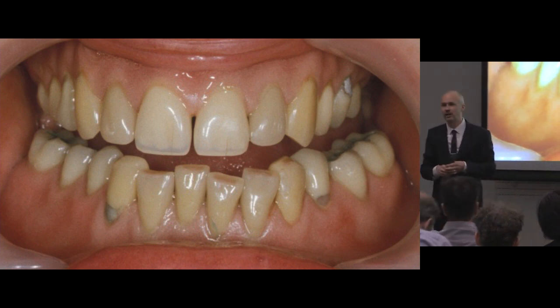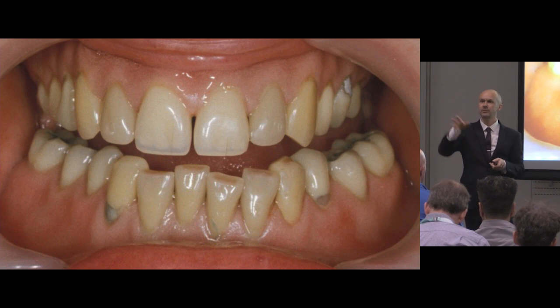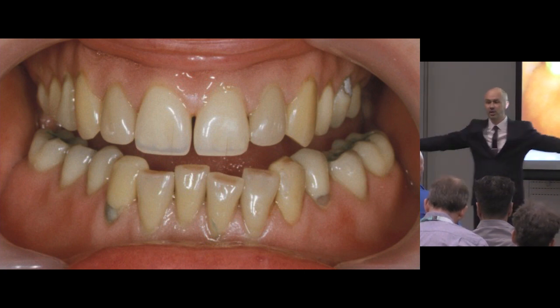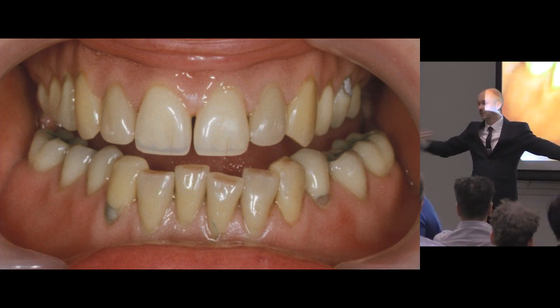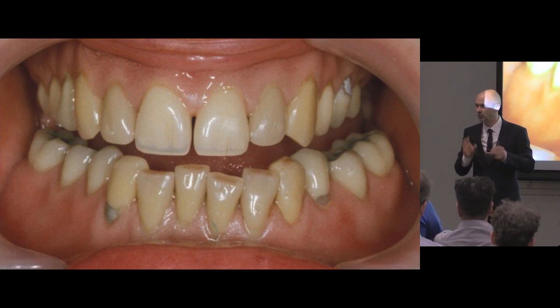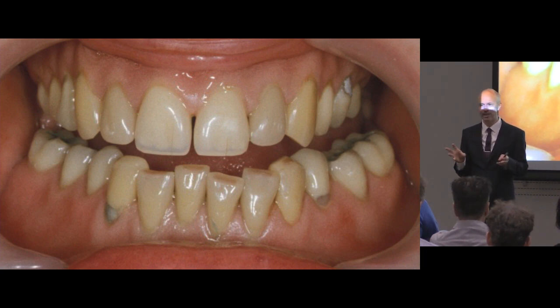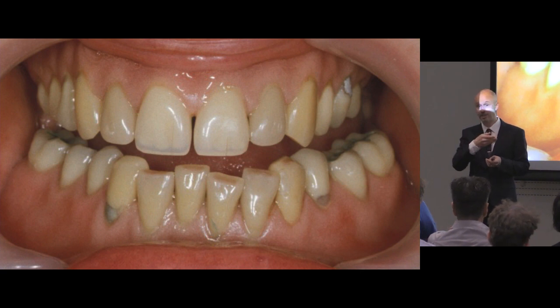But certainly where I live and work, which is in the northwest of England, most of my patients want to have a bit of a halfway house. And what I mean by the halfway house is wonky teeth, but clean and not too light. So maybe A2, wonky, with no characterisation, but with tooth wear, with wear on the incisal edges. So that is my standard approach.